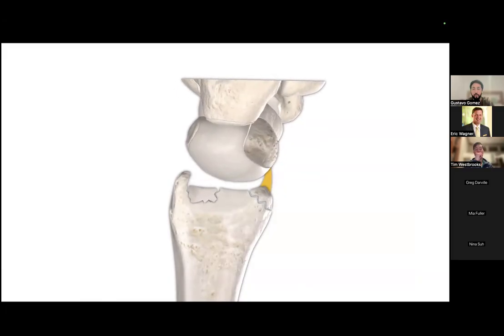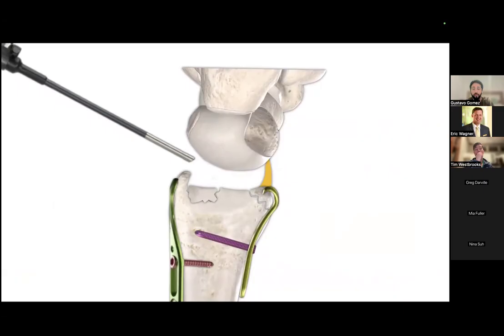So to treat this, we have to reduce the volar rim, and then we fix it with a palmar hook plate. We then place a dorsal plate. We fix just the proximal screw, and then we go to arthroscopy. So we place the volar hook plate and the dorsal specific plate. We fix just the proximal screw, and we go again, I repeat, to arthroscopy, placing the scope through the 6R portal.